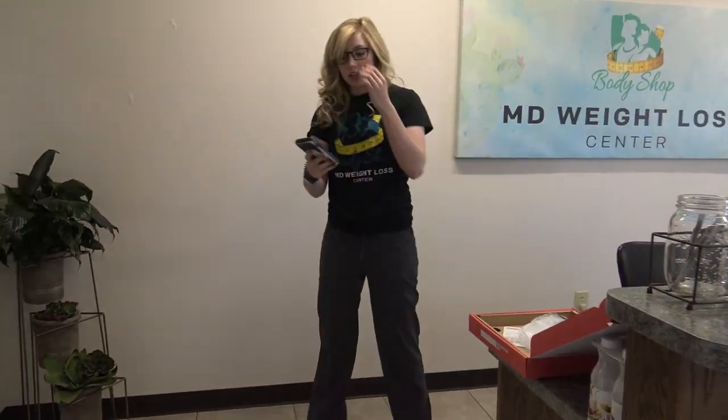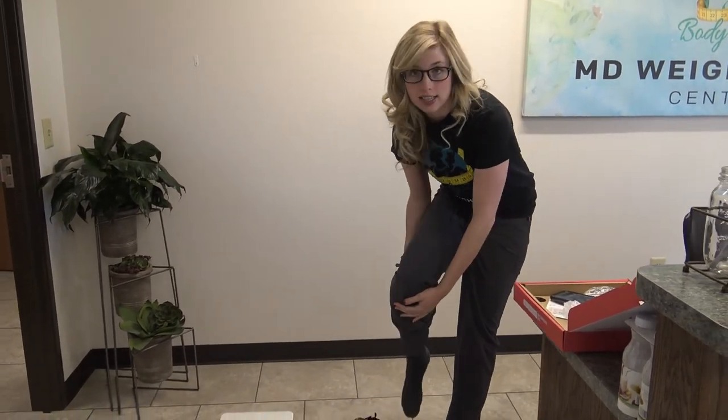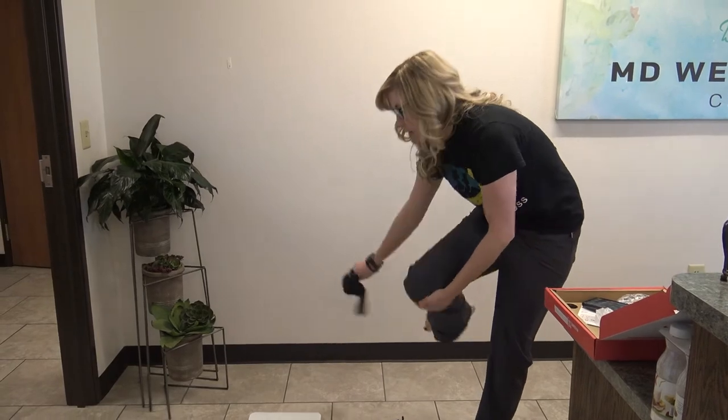Next thing, you're going to grab your phone. You're going to take your shoes and your socks off. It needs that grounding of your feet to be directly against the scale, so don't leave your socks on when you weigh.